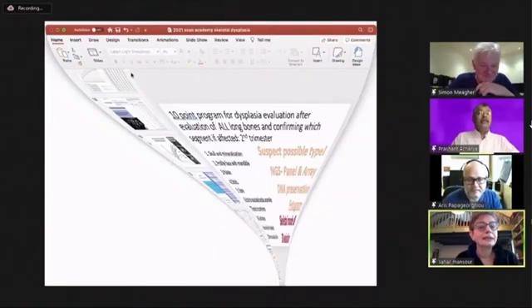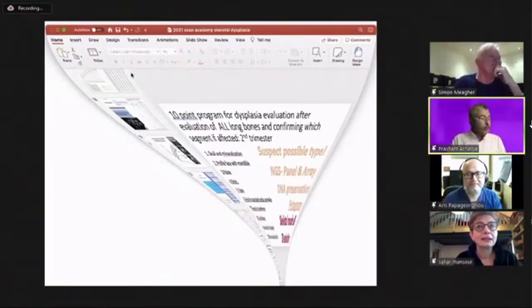Can this tell the difference between all three conditions, can you spot the conditions, whether you have done CVS or amniocentesis or you have done NIPT?